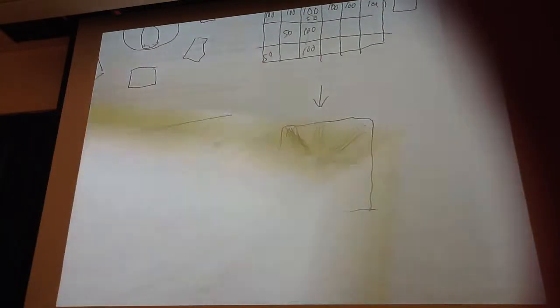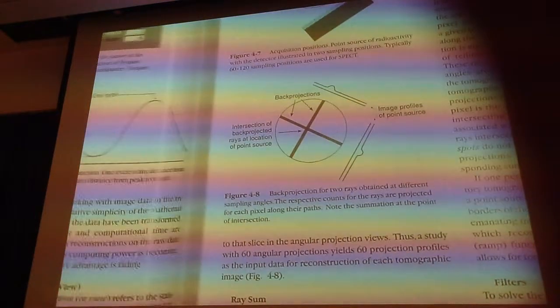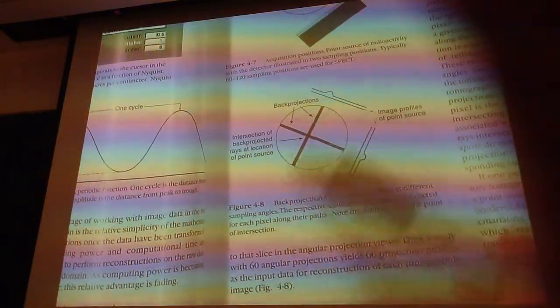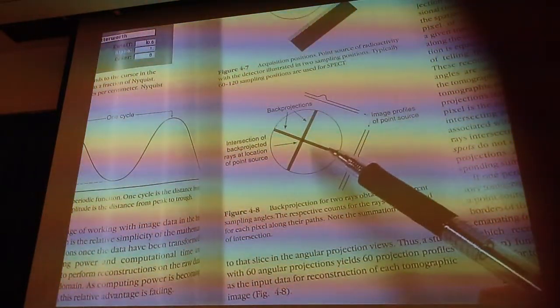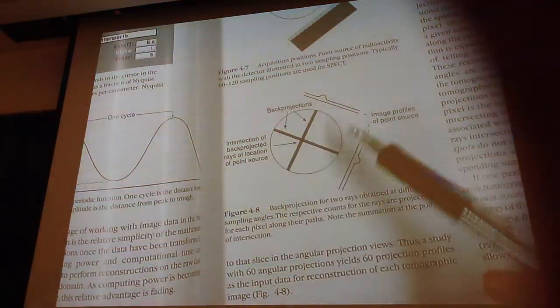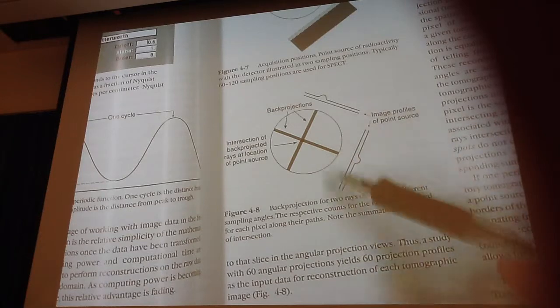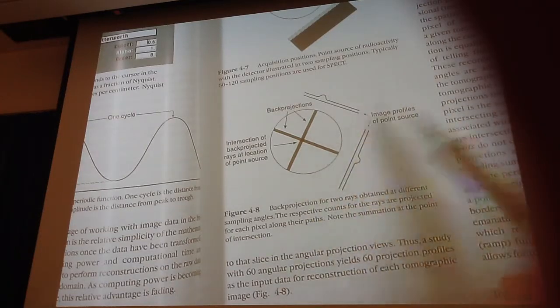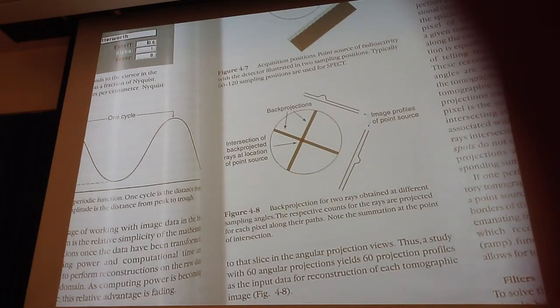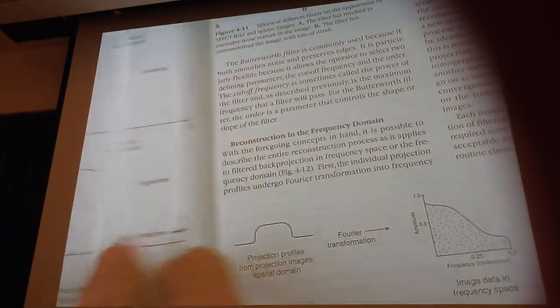on page 57, this kind of gives you an example of what they're talking about. We know that there's something along that position there, but if you imagine there's 64 projections taken, 32 if we're looking at the heart. So the problem is if we don't eliminate that, then we're not going to get a very good picture, are we? This is what it's going to look like.